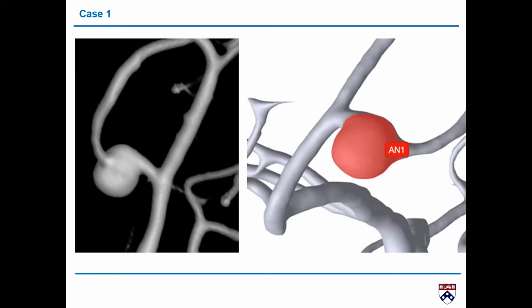reformatted CTA. Let me ask you a little bit more about that last statement, because that's also pretty striking to me, where you can look at an aneurysm on a CTA or an MRA, and sometimes I find myself telling the patient, look, maybe this could be just coiled, maybe this would need a stent coiling, maybe this is amenable to a web device. Whereas I feel like what you just showed would be much more clear in how you might consent a patient for treatment ahead of time. Could you maybe talk a little bit about that?